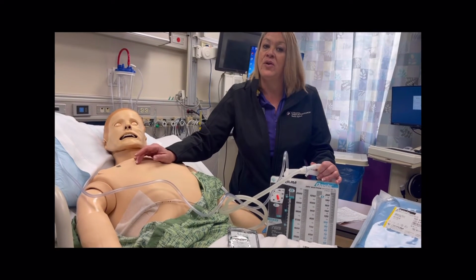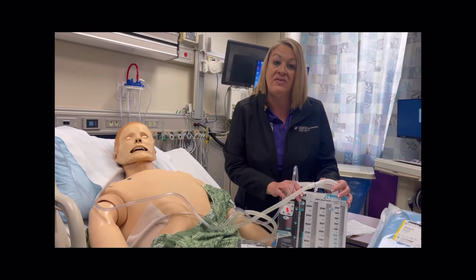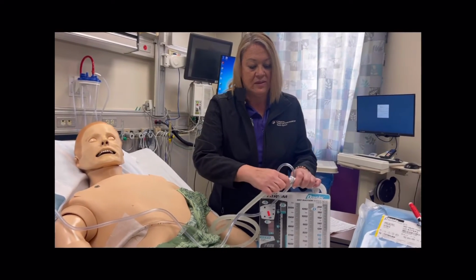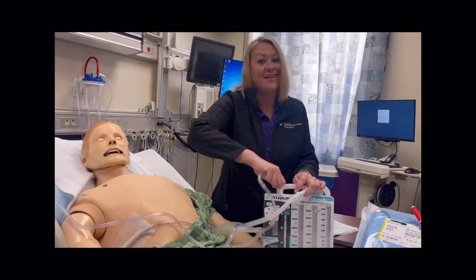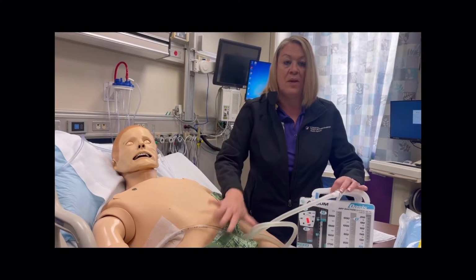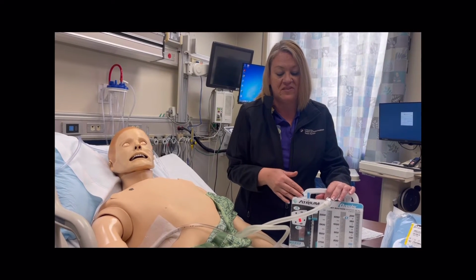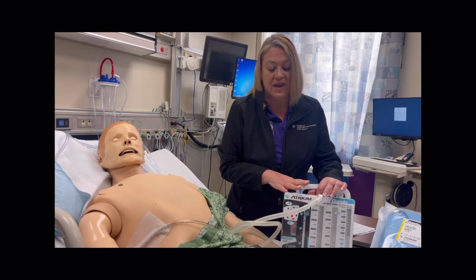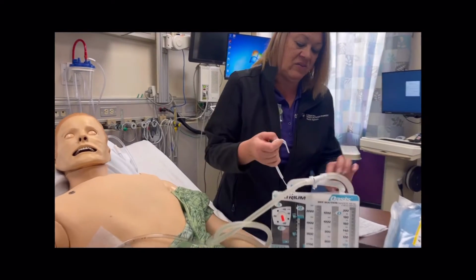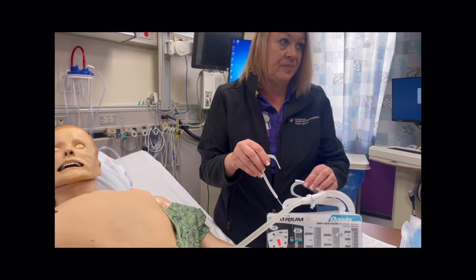Some final tips for your patient: if you're traveling with your patient, going to chest x-ray, MRI, and these are MRI compatible, you would disconnect from your suction tubing. You would leave this obviously in the room. This travels with the patient below the level of the chest. For the purposes of this discussion and demonstration, you see me having it up on the bed, but this is not where we would have it. There are clip hangers, and this attaches to the rail of the bed so that you can travel.